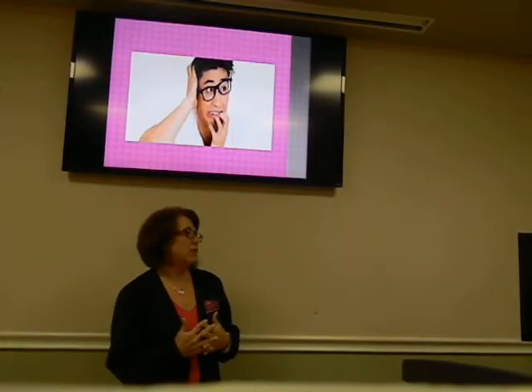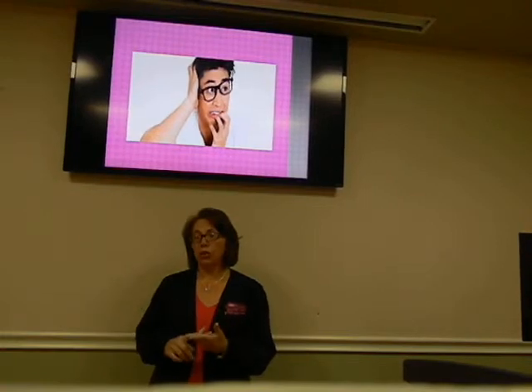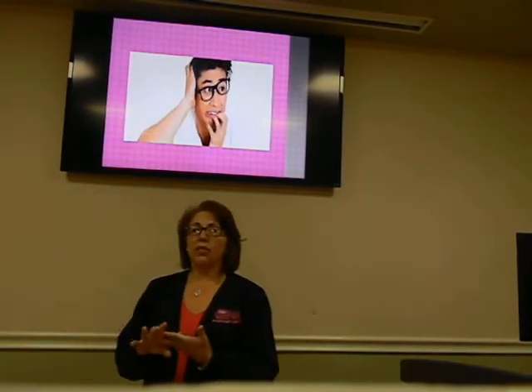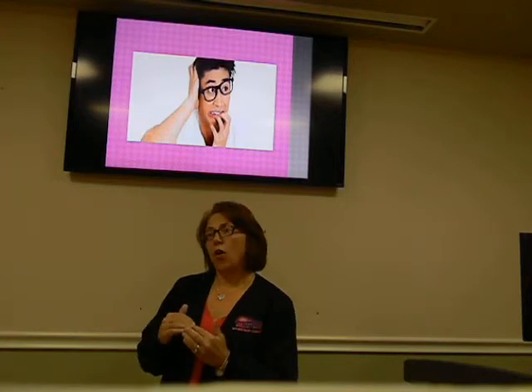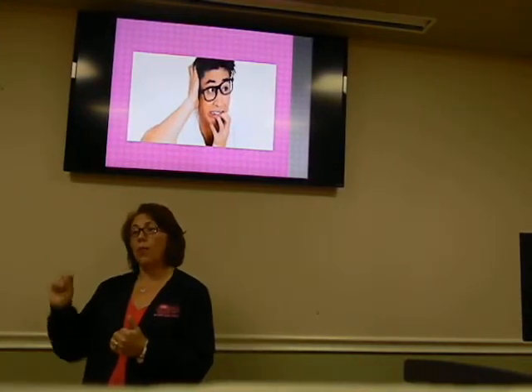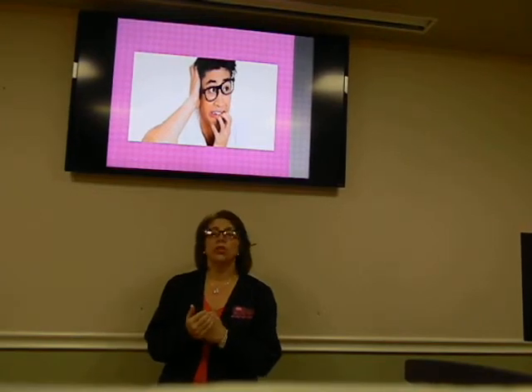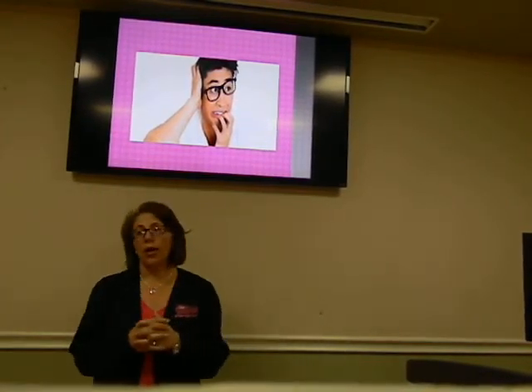So next time that you are there, you will know that in conclusion, if the heart rate is between 110 and 160, it has a normal baseline rate between those two numbers, that there are accelerations, which are the squiggles that go above the baseline, and that the baseline rate has squiggles, then we're talking about a healthy baby. And that's what we want at the end.